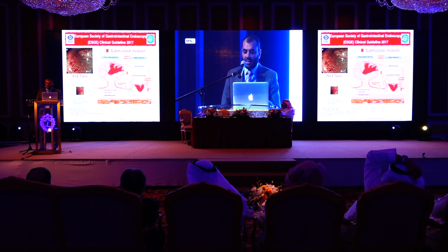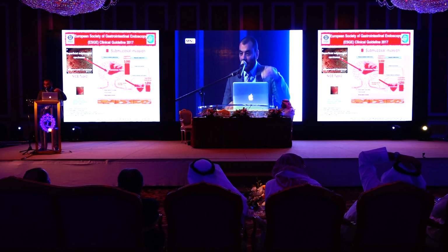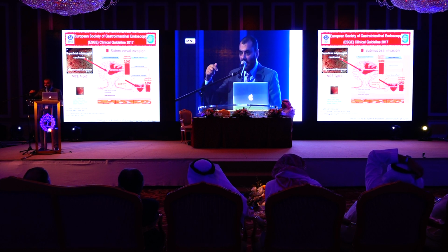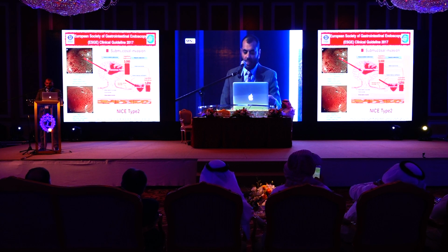However, as we mentioned, if there is cancerous tissue here, and this cancerous tissue is confined to the mucosa and doesn't invade the muscularis mucosa, here, the muscularis mucosa, this line, this is intramucosal carcinoma. And if this cancerous tissue invades deeply but less than 3,000 microns, it will be superficial submucosal carcinoma. So all the 3 types are NICE type 2, meaning I can still remove it endoscopically, with no need for surgery, because I don't expect lymph node involvement.